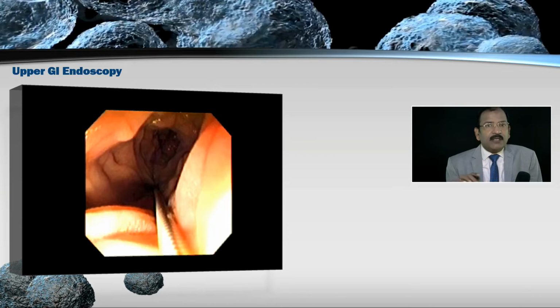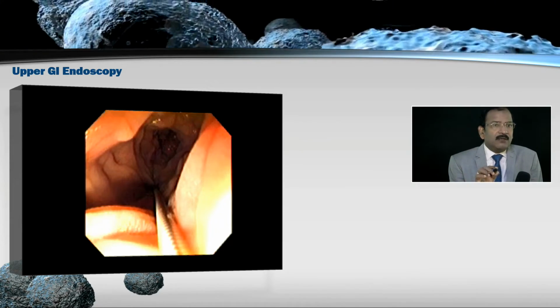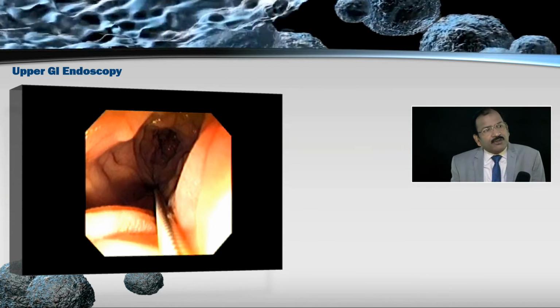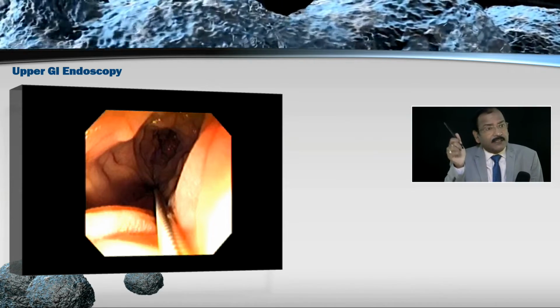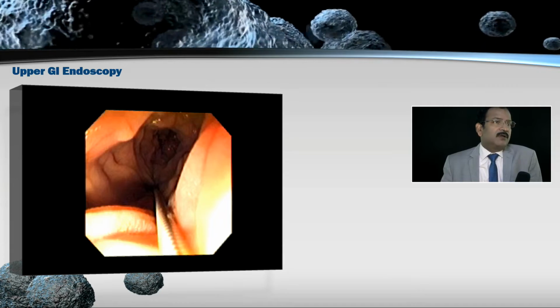Exactly the same way during entry, you should not take a biopsy or do anything or try to spend your time. Initially, you should try to enter as soon as possible to the remote destination. And while you are withdrawing, take your time to do the diagnosis.